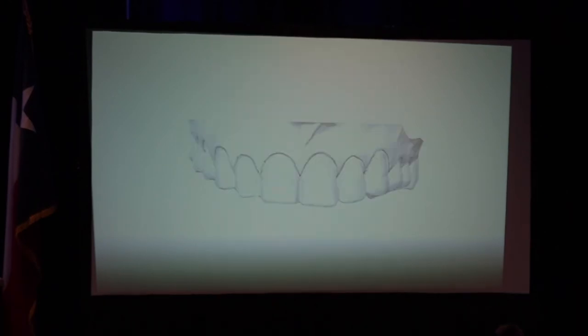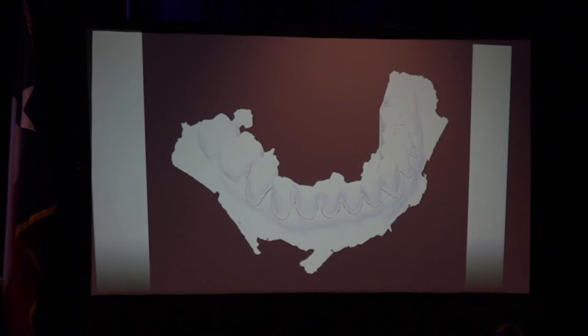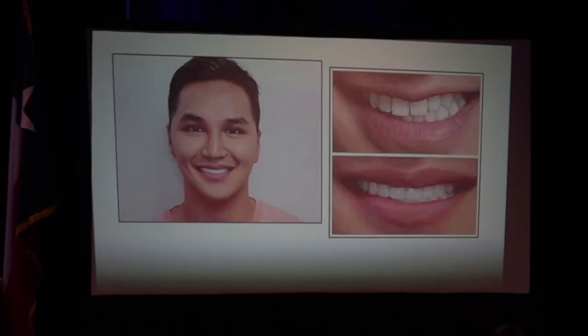So I'm just showing, it's a little bit hard to see on this monitor here, that this is a digital intraoral scan. What we were showing yesterday is that we're taking a PVS impression and it would go through a lab scanner. Either way it would work, I'm just showing you that it's hard to see on there. So we went from before and that's the after. How did we get there?